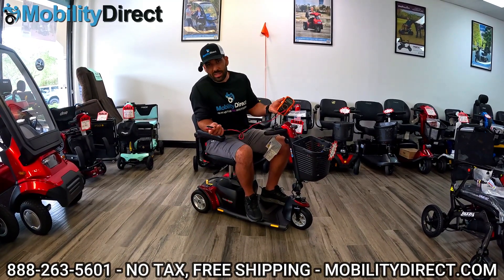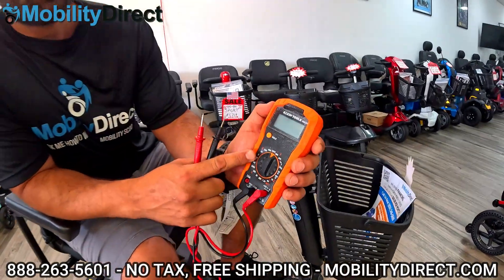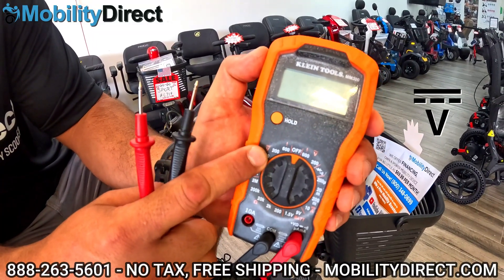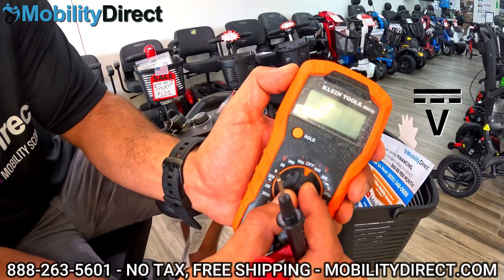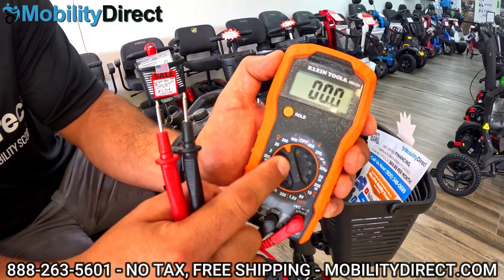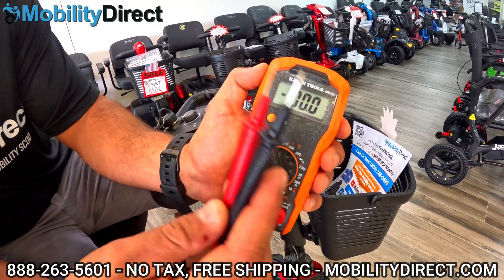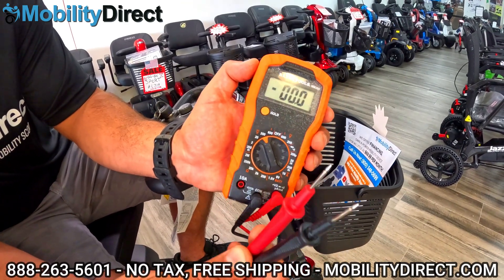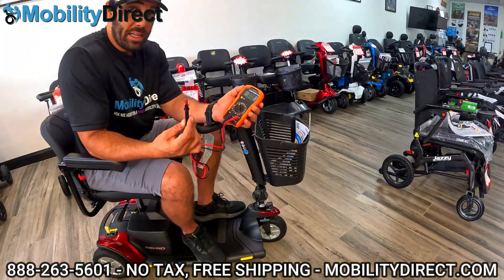If you don't know how to use one of these, it's pretty easy. On your voltage meter, you should have a little V, which stands for voltage, with two lines — one is a dotted line and one is a solid line above the V. You're going to want to go to that section and put the dial at 200, which is going to max out at 200 volts. That's fine because scooters normally operate at 24 volts. You've got your probes — your positive and your negative probe — which you can plug into your charging port to get a readout on your battery voltage.